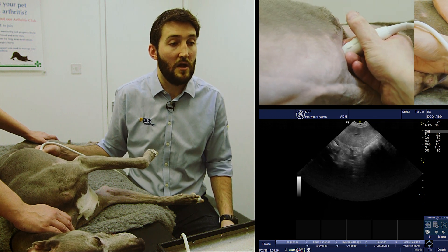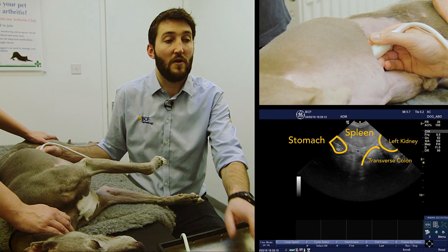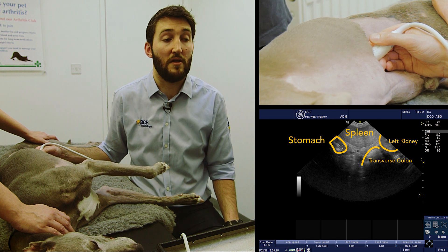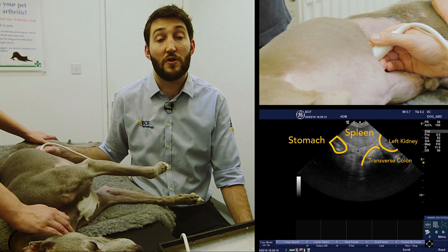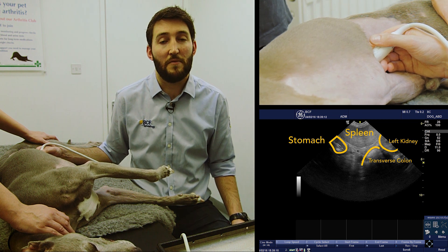If I pause the image here, we can see on the left of the screen gas shadowing from the stomach — we can see the stomach wall — and spleen at the top of the image. Just creeping in on the right of the image we can see the transverse colon.